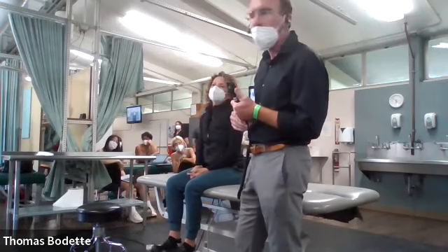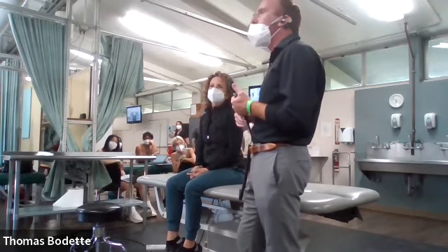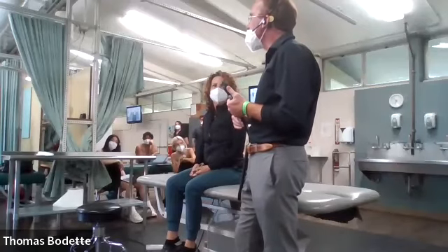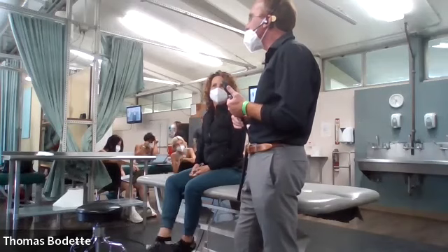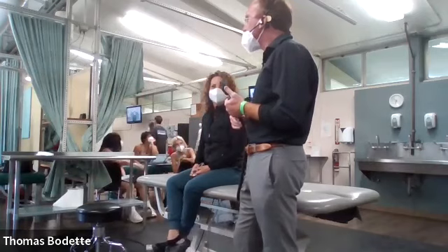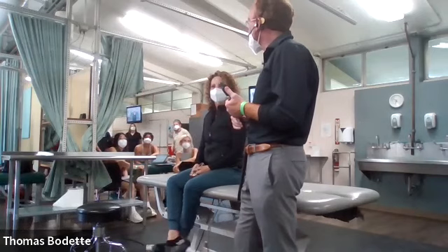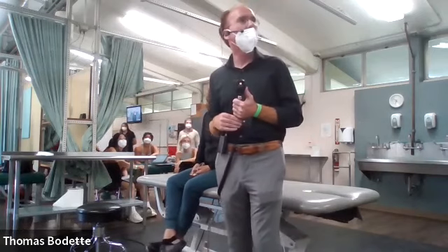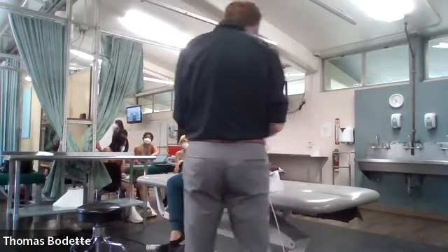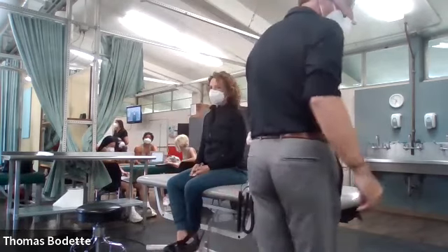So it's 10:32. So I can turn the lights down to make it a little easier for you to see. And I can give you time to struggle through this one more time. Or I can demonstrate otoscopy. You want to see otoscopy before I give you a chance to practice anything? Okay, works for me. Okay.